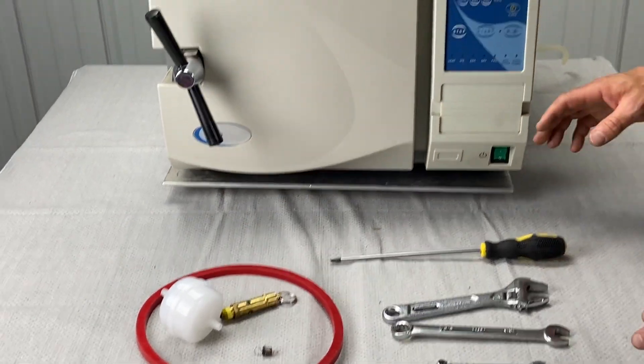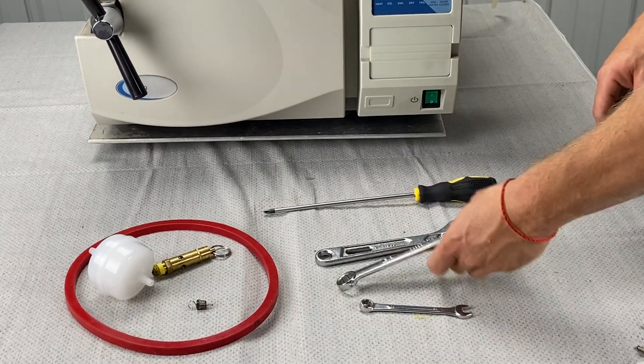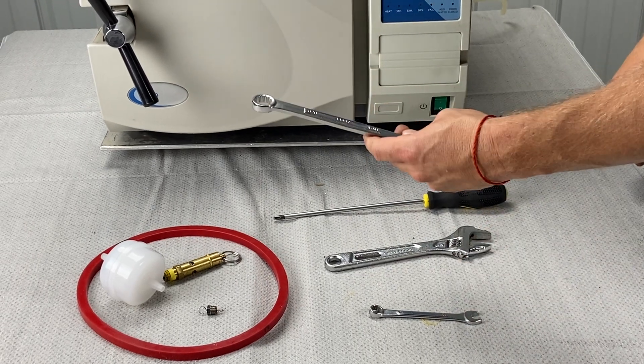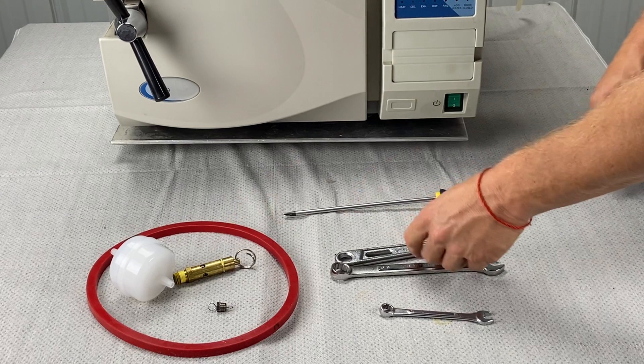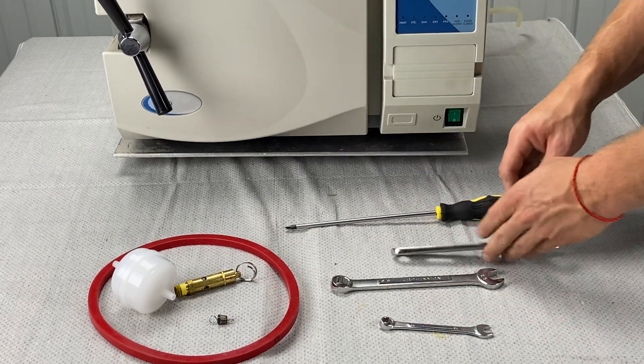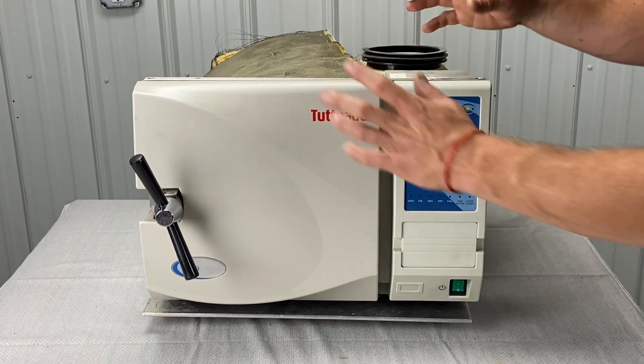What you'll need is a 10mm wrench, a 5/8 wrench — you might also need a 3/4 wrench depending on how big your original safety valve is — and an adjustable wrench.